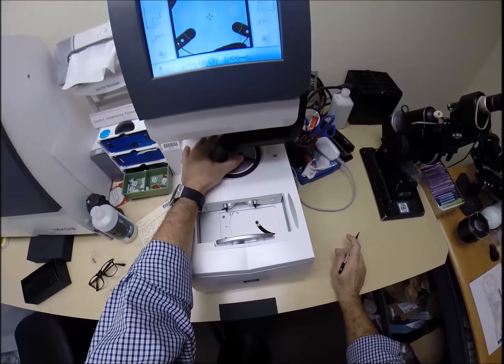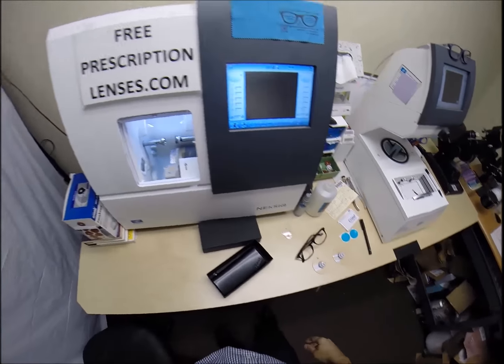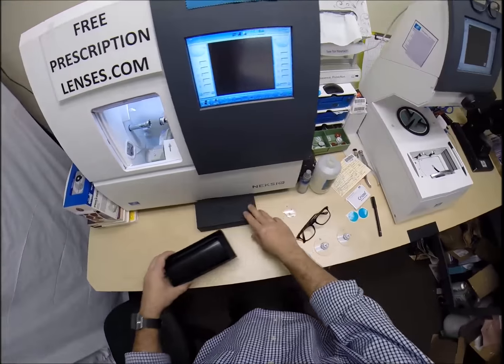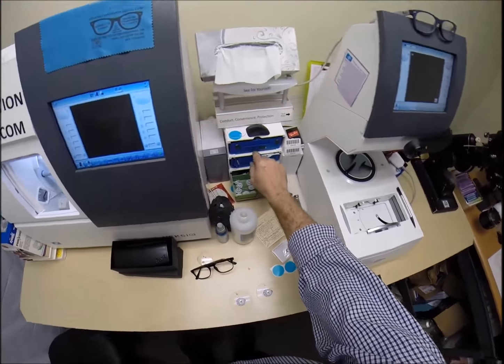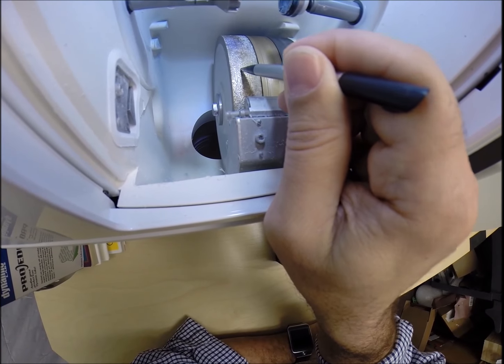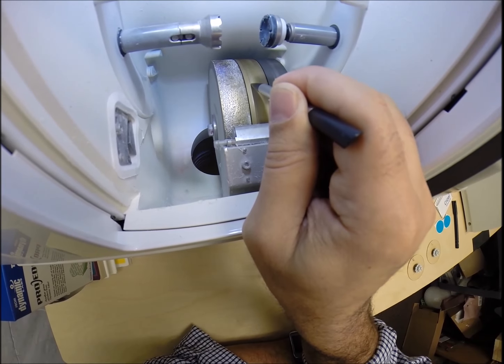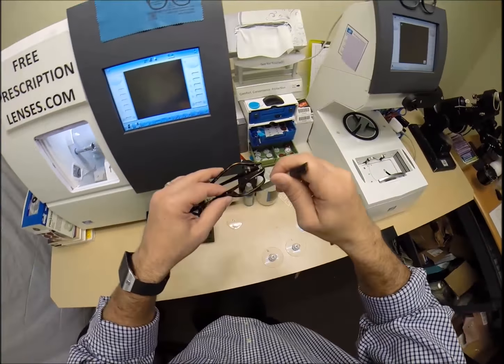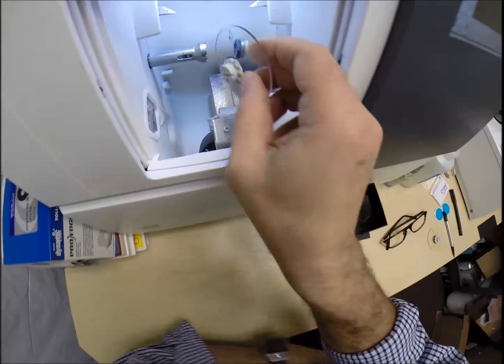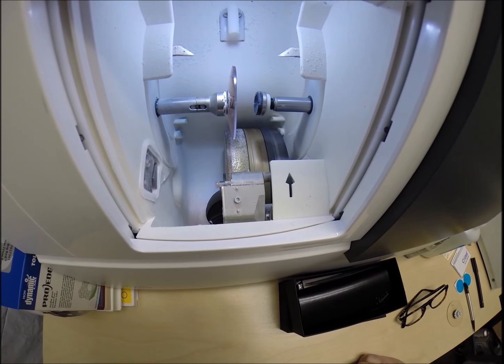Your pupillary distance is 68. The computer starts at 32.5 - I'm going to tap the plus button until we get to 34. We're going to move the optical center up - the seg height, the segment height - to 24. The geometric center of your frame is 19, so we tap that box and go up to 24. This is a single vision layout, but because this is an invisible bifocal, I tap this button and it gives me a list: progressive, line style bifocal - we're going to put it on the progressive.